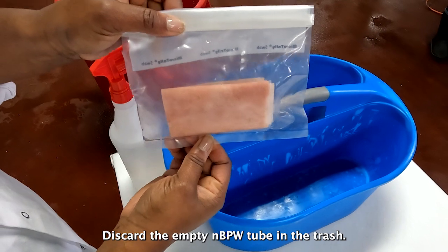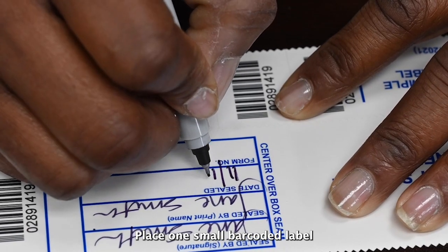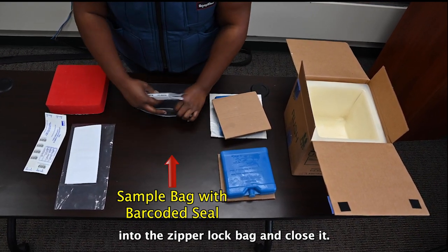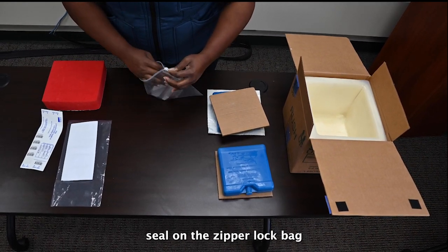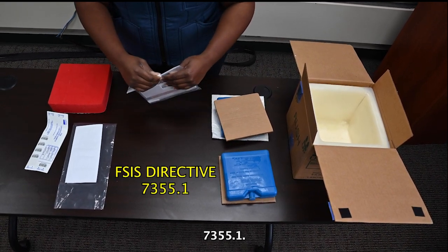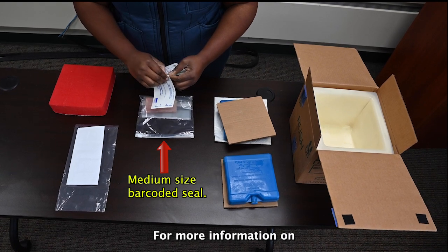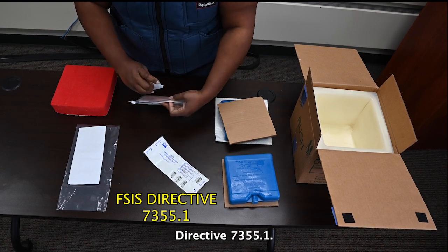Discard the empty nBPW tube in the trash. You are now ready to label the sample. Place one small barcoded label on the sample bag containing the cloth. Then place the sample bag into the zipper lock bag and close it. Include a medium-sized barcoded seal on the zipper lock bag as described in FSIS Directive 7355.1. Place the labeled and completed sampling form in the plastic sample form sleeve. For more information on using the barcoded labels, please see FSIS Directive 7355.1, Use of Sample Seals for Program Samples and Other Applications.